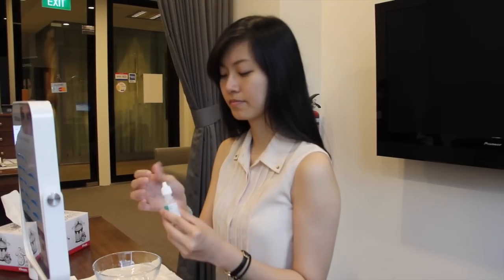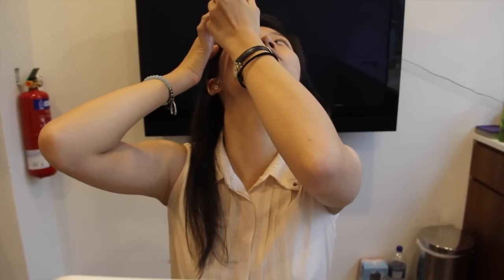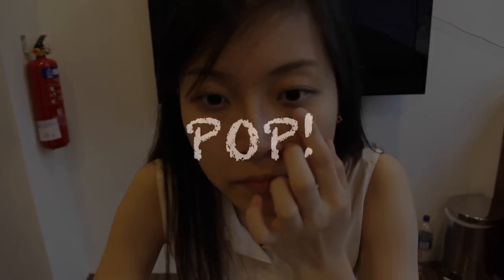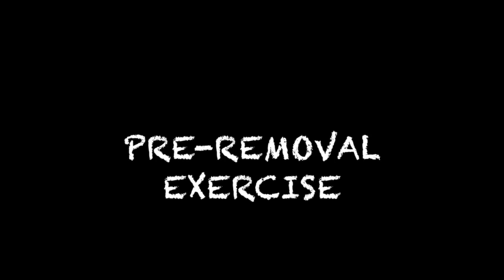The first step will be to instill one to two drops of eye drops into your eyes. It is very important to ensure that the eye drops seep in between the lens and your eye. This allows the suction between the lens and your eye to be broken and enables you to remove the lens without difficulty. You should not hear a popping sound when you remove the lens. To ensure that the eye drops seep between the lens and the eye, we need to do a quick massage.